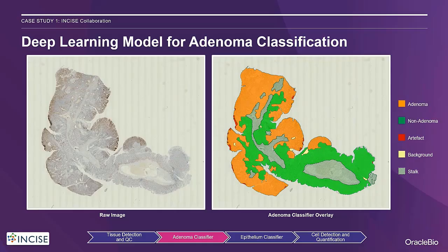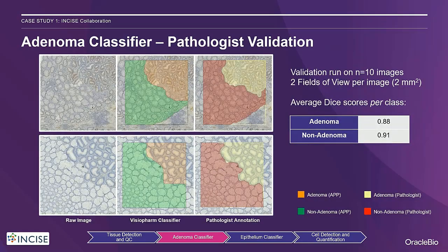So here I'm showing a few examples of the pathologist-led validation we performed throughout the course of the study.